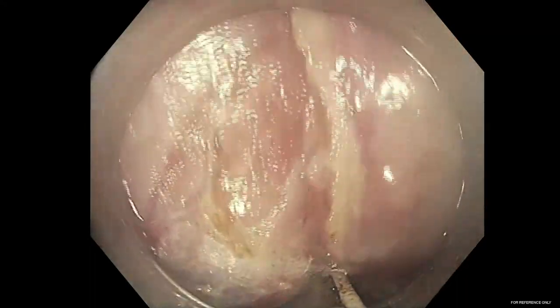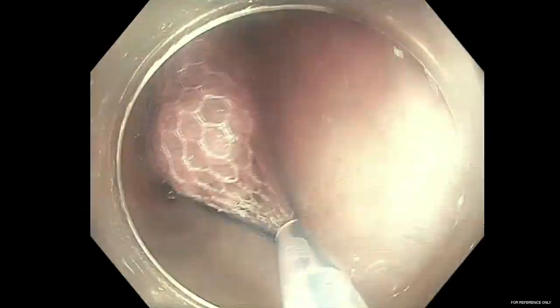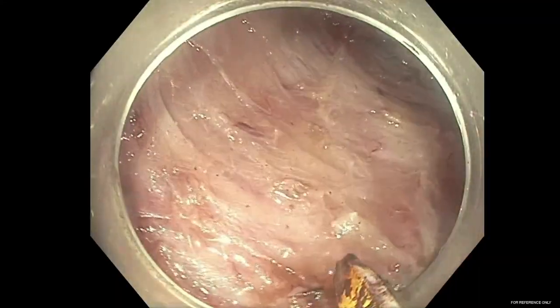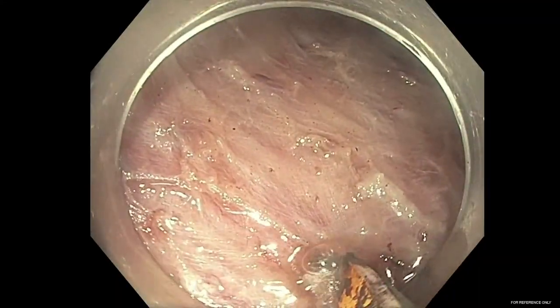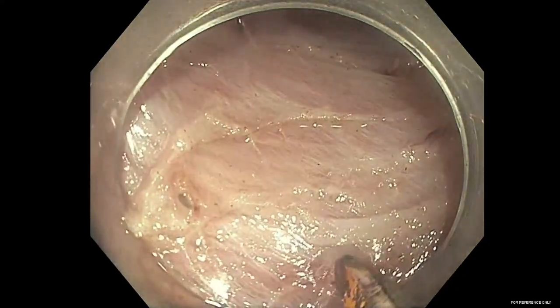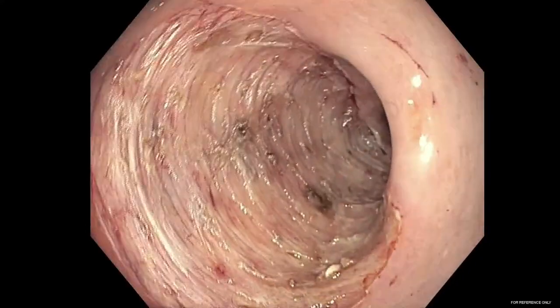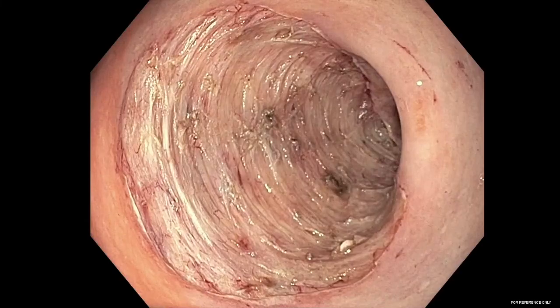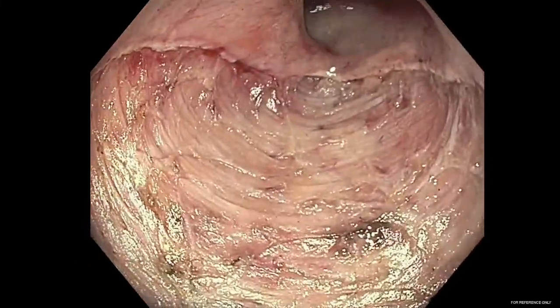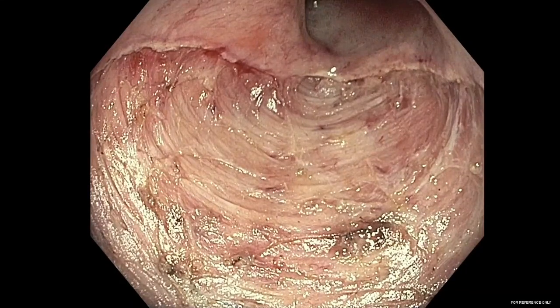After dissection is complete, a mesh retrieval netting device is inserted to remove the en-bloc specimen. Upon removal of the lesion, the Speedboat RS2 device is reinserted to perform coagulation of visible vessels under 10 watts of microwave coagulation.